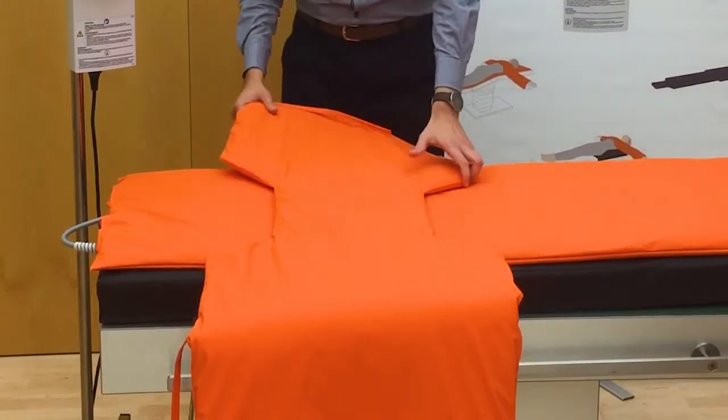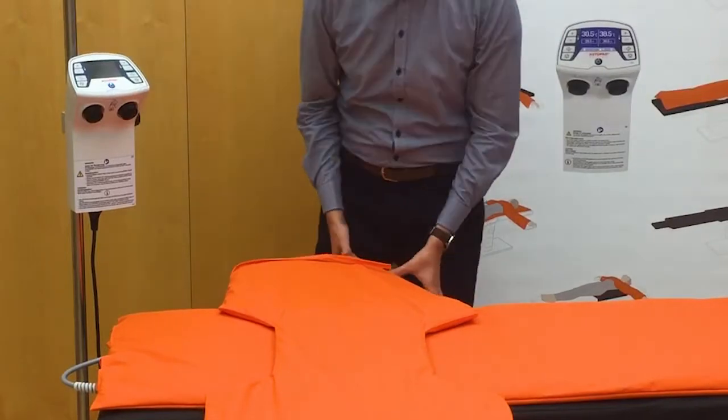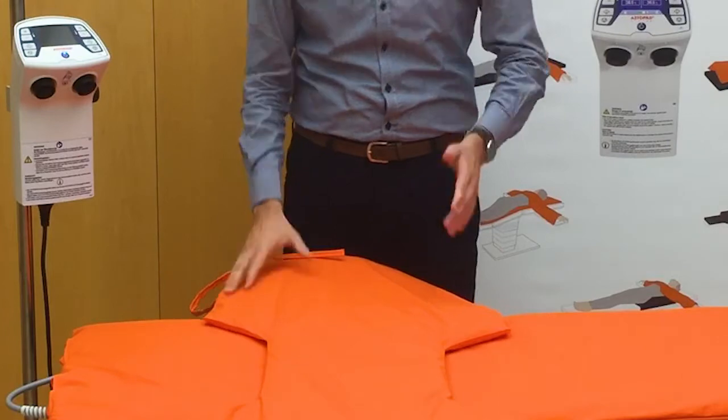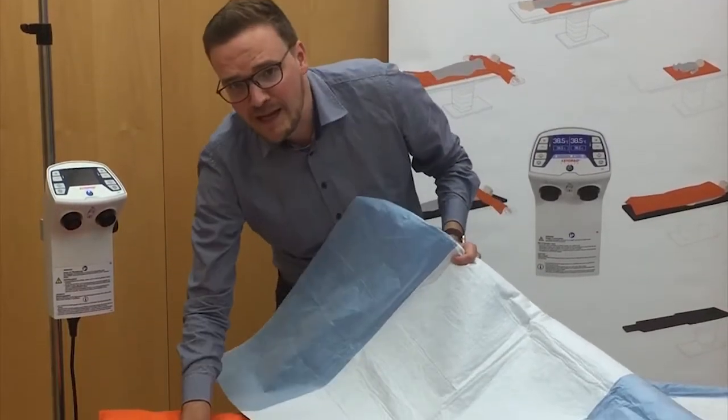If the OR tabletop is tilted or adjusted through the longitudinal axis, there is a danger that the patient will slip off. The patient must be sufficiently secured against slipping before the OR tabletop is tilted or otherwise moved out of the horizontal position. For using the Astopad blanket on top of the patient, place the blanket lengthwise or across over the patient with the cable connection side facing away from the patient. All Astopad blankets may be used with an OR sheet or drape between the warming blanket and the patient.